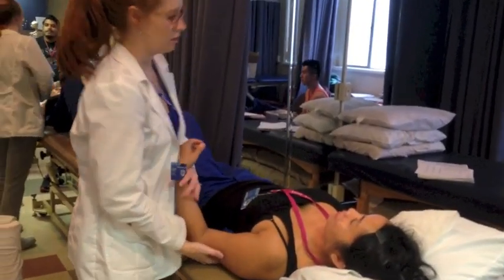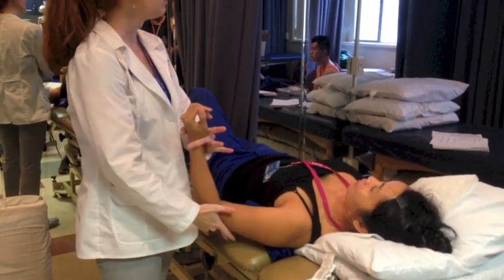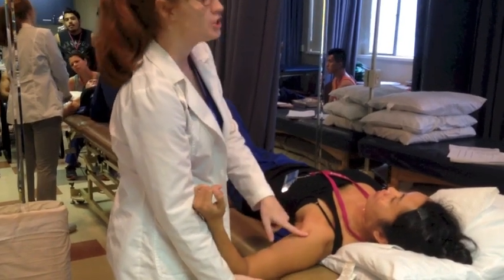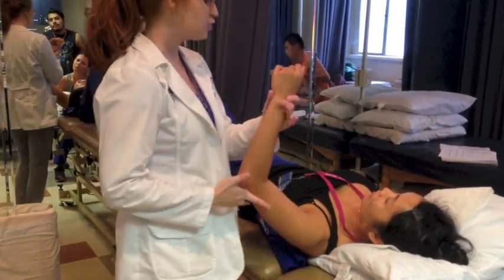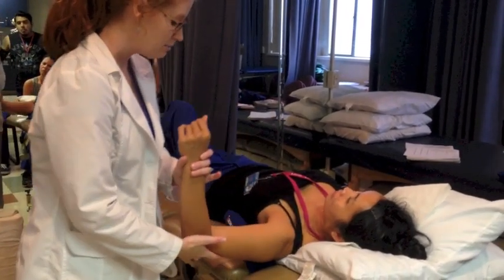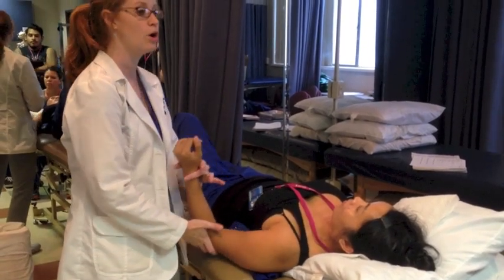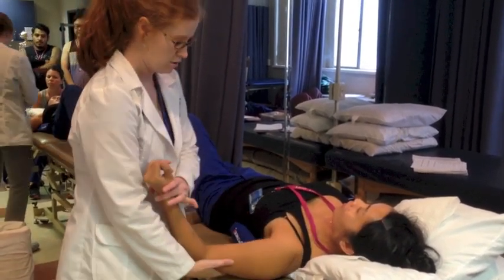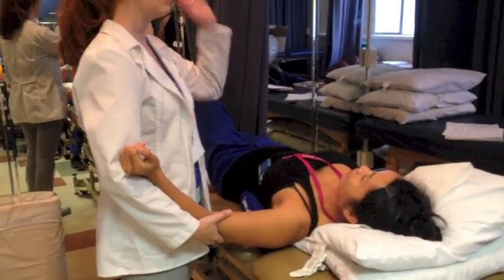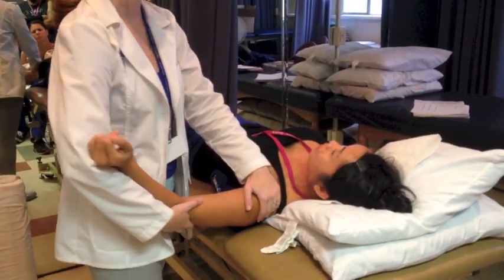I'm going to start bringing her around. I'm going to be very careful to keep her arm in the same plane. If I let the elbow drop, we've gone into relative extension. If I bring the elbow up too high, we're going into horizontal adduction. So you want to keep this arm in the same frontal plane to make a pure abduction motion. I'm bringing her up, cradling, and if I notice her shoulder coming up, I can help keep it down.